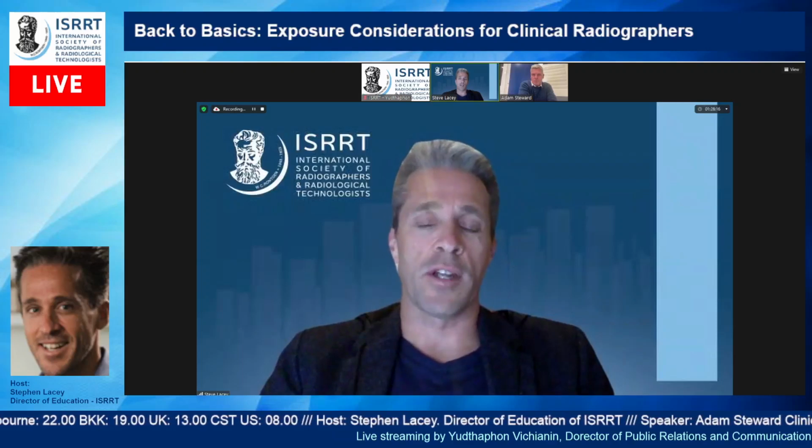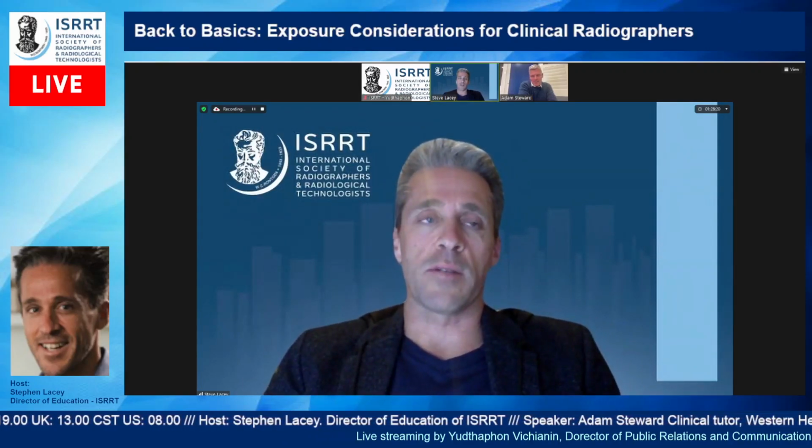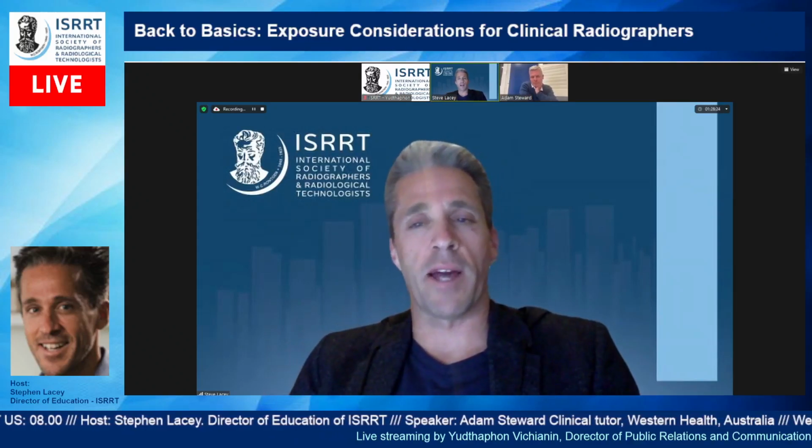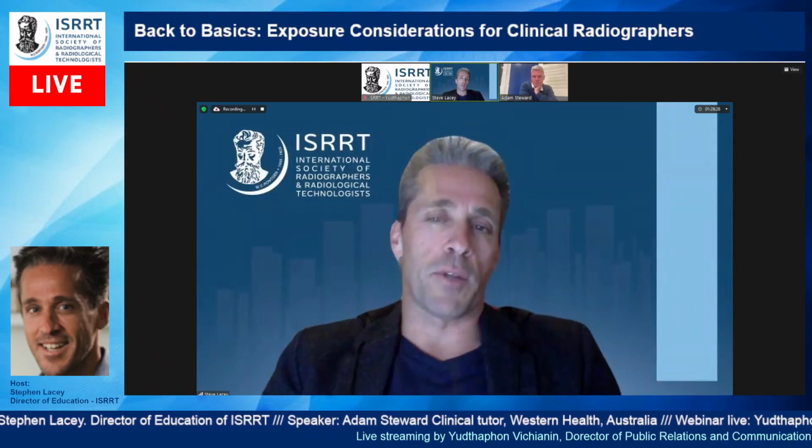The other question, Adam, was about grid use. Actually, this is my question. You talked about the grid law, your own grid law being 12 centimeters is when you start using the grid, and you explained that when it was related to something like the knee, for example. Do you apply the same concept when you're looking at the torso, like your chest and your abdomen?